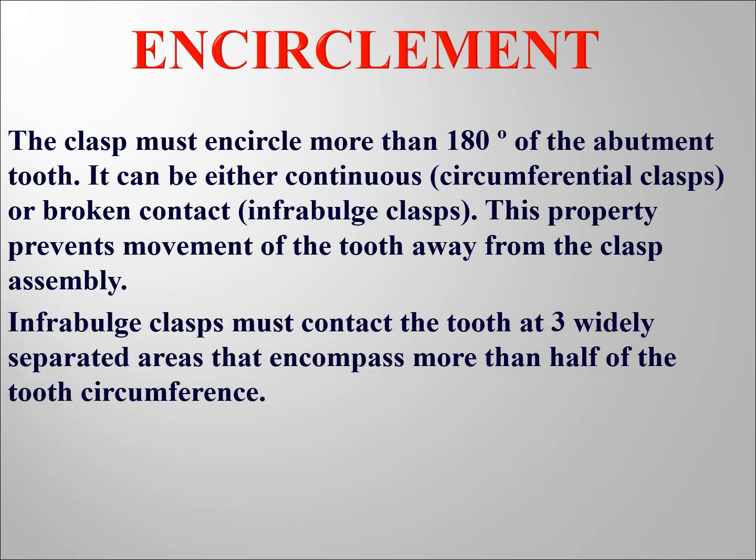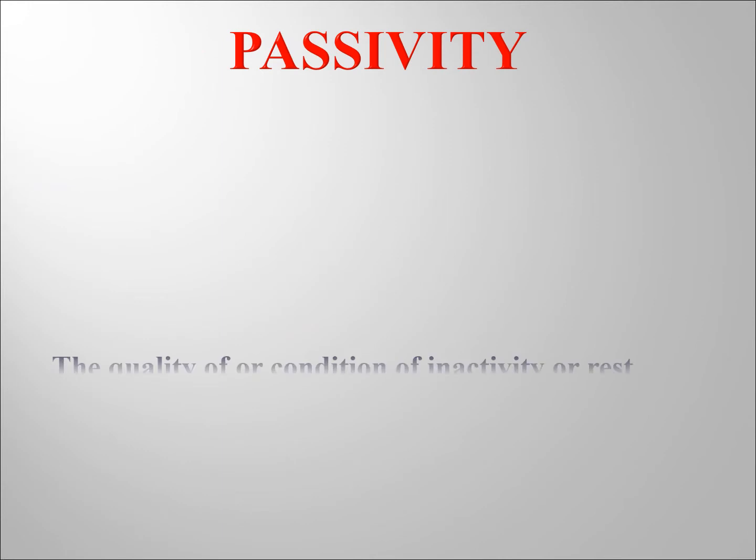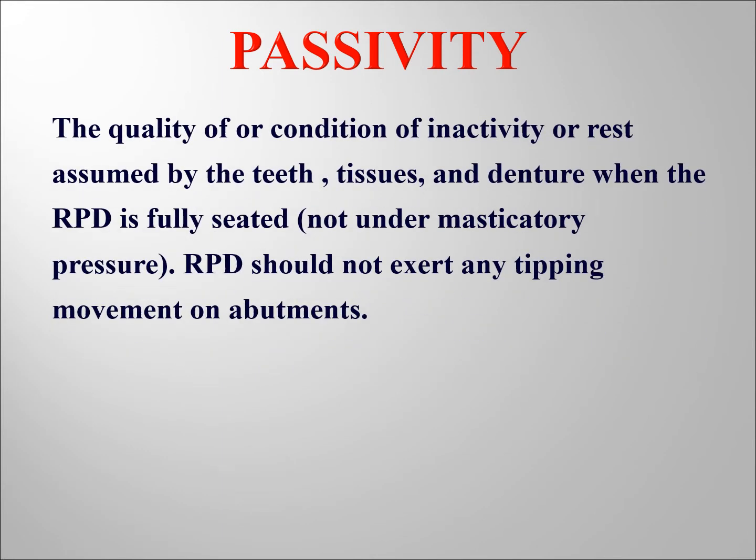All right, now passivity is also a very important requirement of the clasp. It's the quality or condition of inactivity or rest assumed by the teeth, tissues and denture when the RPD is fully seated. It should not exert any force on the tooth or tissues while it is seated in its place.